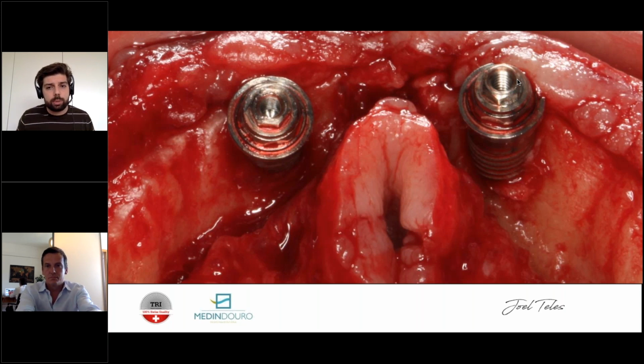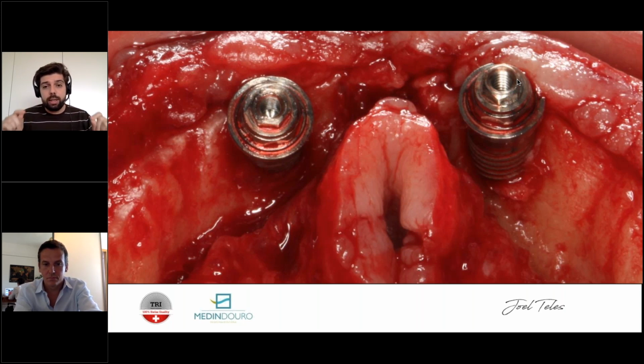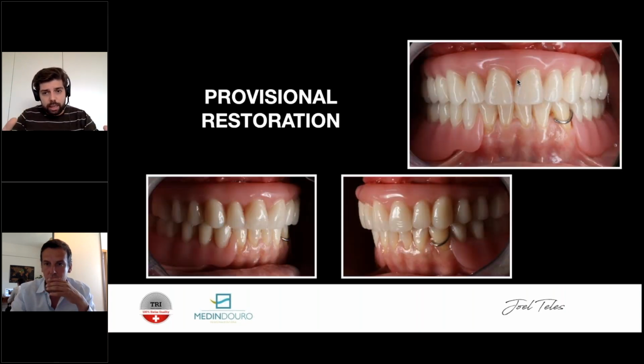Taking a closer look, this is what you get on the palatal side. You get all these threads exposed, and you do nothing. You trust this thick periosteum of the palatal side. Literature shows there's no difference if you graft or if you don't graft. So if there is no difference, don't say I feel most secure if I graft, because that means nothing. What we should do, and for me this is perfectly clear, is follow what is described as the best way. And the best way in this scenario is the simpler way: do nothing, trust your periosteum, and hold it against the threads of your implant.